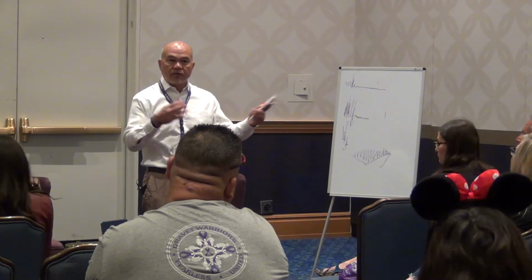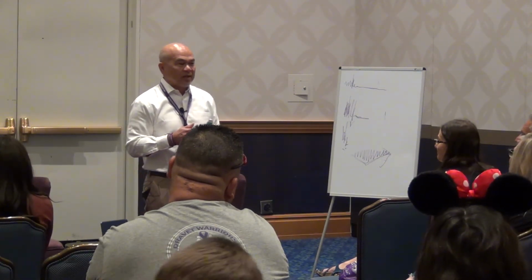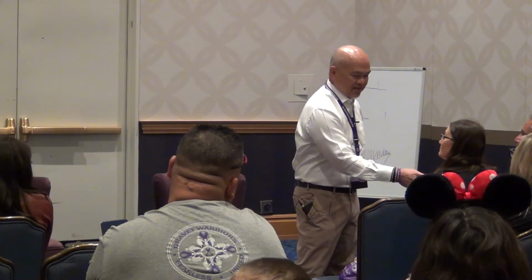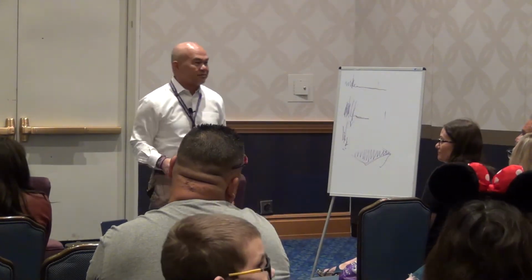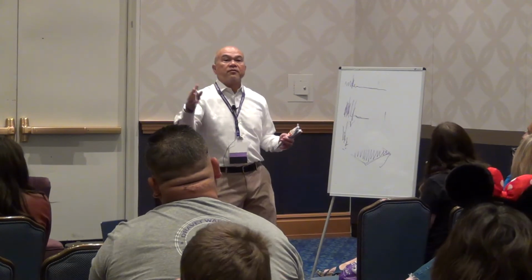You could tell. That's why when we have EEG, we have the video, because it could be very hard. If I do this while she's getting an EEG, I could make her EEG look like she's having a seizure. That's what I always wondered. Yeah, you could. That's why we have to have the video.